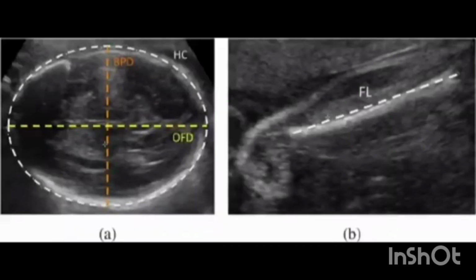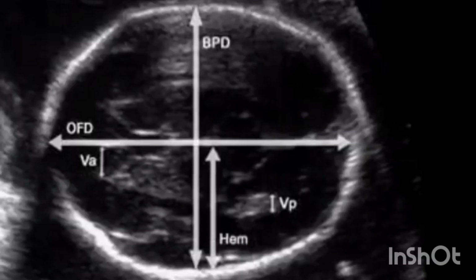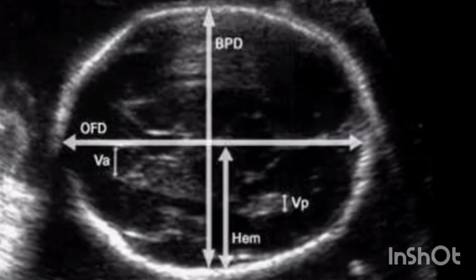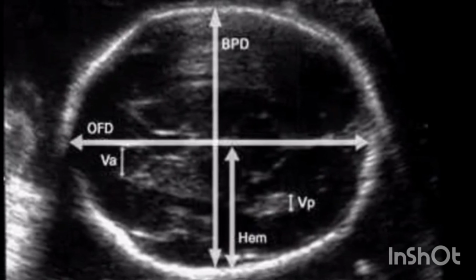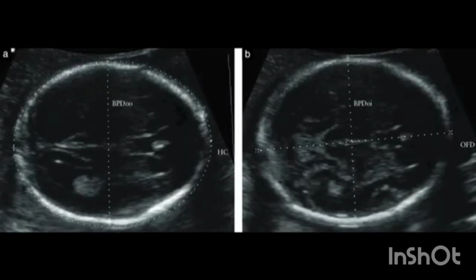The head-abdominal circumference ratio decreases with advancing pregnancy. Biparietal diameter may also be influenced by factors such as abnormalities of head shape, breech presentation, or multiple gestations. Head circumference, HC, may be a more reliable measurement if there is variant head shape.